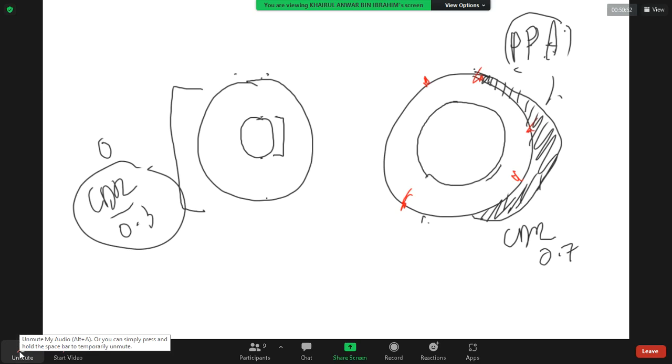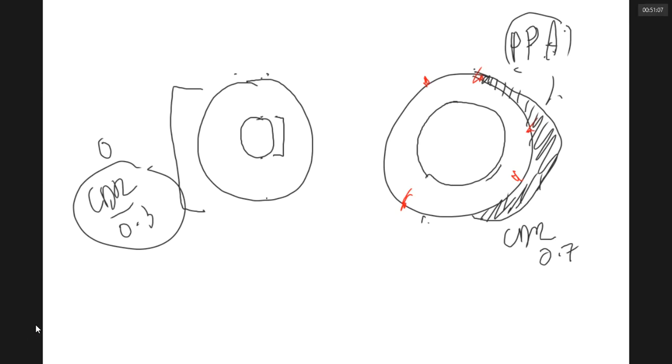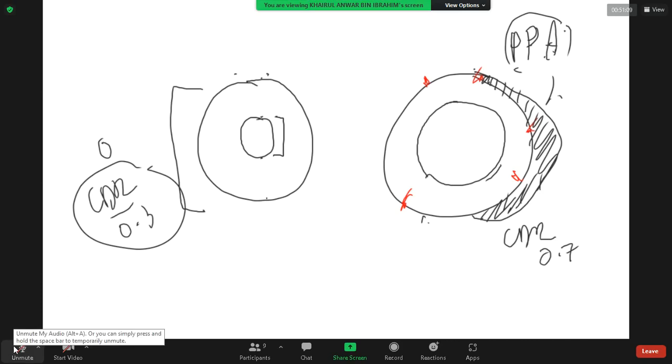No, you don't have to. Unless you see there's a big lesion over there, then you draw and color that lesion, but you don't color the background. That's right. As I've mentioned before, even though in the lectures I did mention that red color is for the normal retina, you don't have to color the whole retina actually. You just draw and color the lesion.